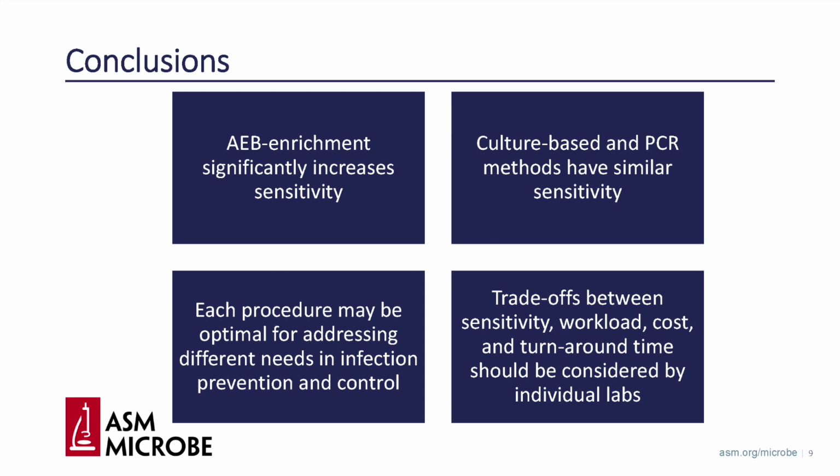For example, both direct-to-agar and broth-enriched cultures may be optimal for being implemented as routine screening procedures, as they have lower relative costs and workload, making them more cost effective and more easily integrated into the existing clinical workflow in order to support the higher volume of screening, while also maintaining similar sensitivities as their PCR-based counterparts. However, for situations that demand more rapid identification, such as in outbreak situations, PCR-based screening methods might be preferred despite the higher cost and workload in exchange for the rapid turnaround times.